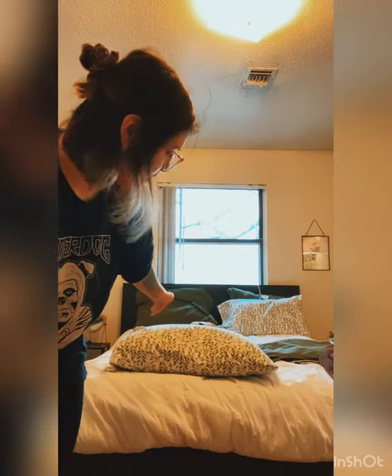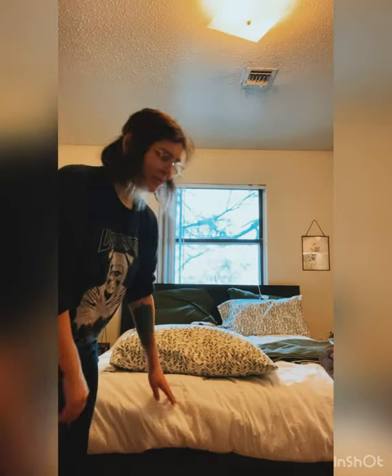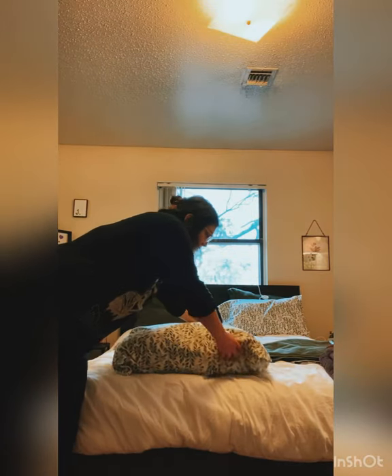I'm going to be demonstrating how to give a resident a bedpan. This is the head of my resident, and this is the bottom of my resident.